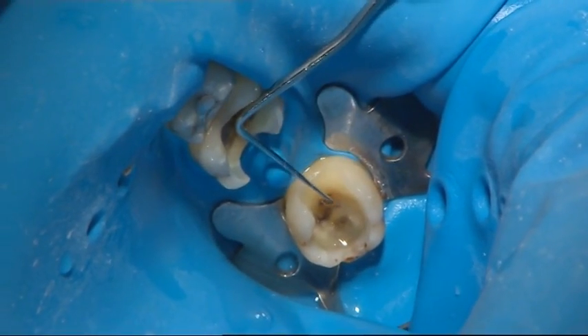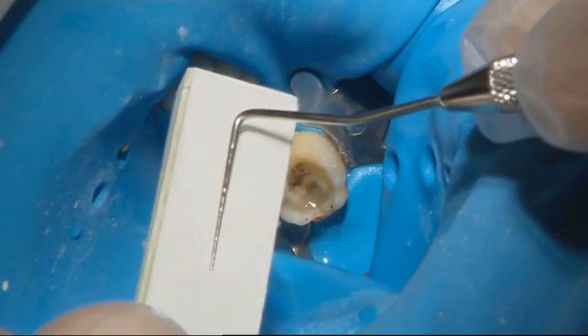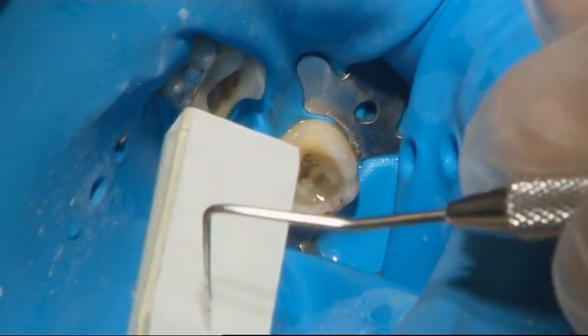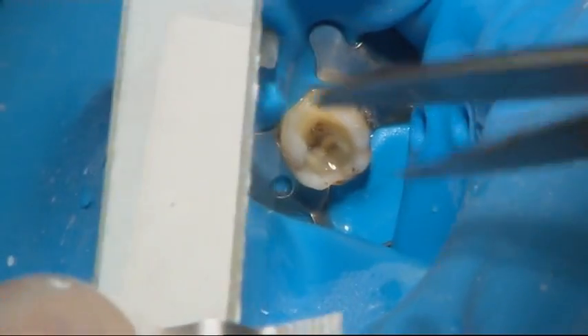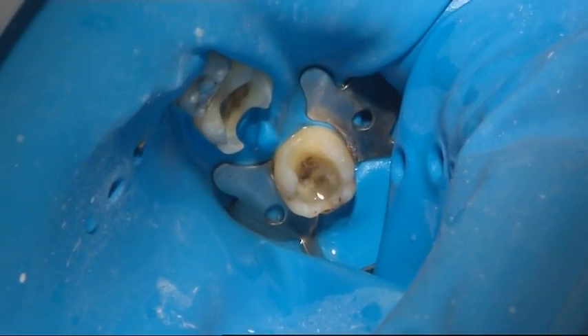The required length of fibres was measured to make the fibre frame. The required length of fibres was then cut together with the silicone bedding, and the cut fibre pieces were shielded from the light until needed.